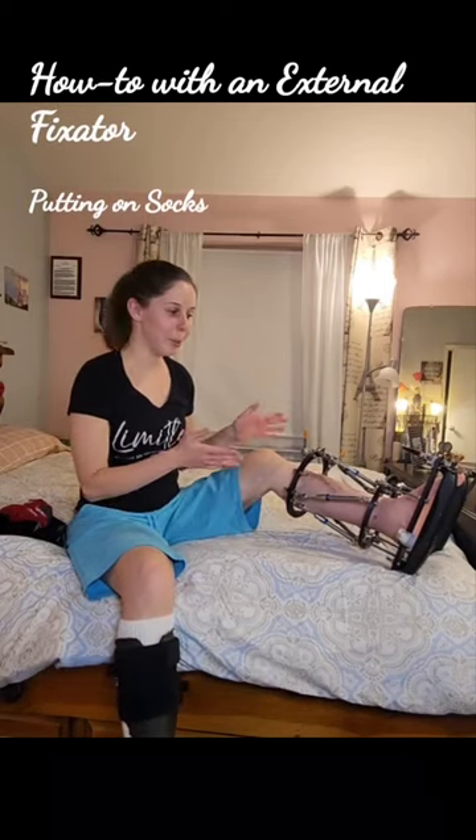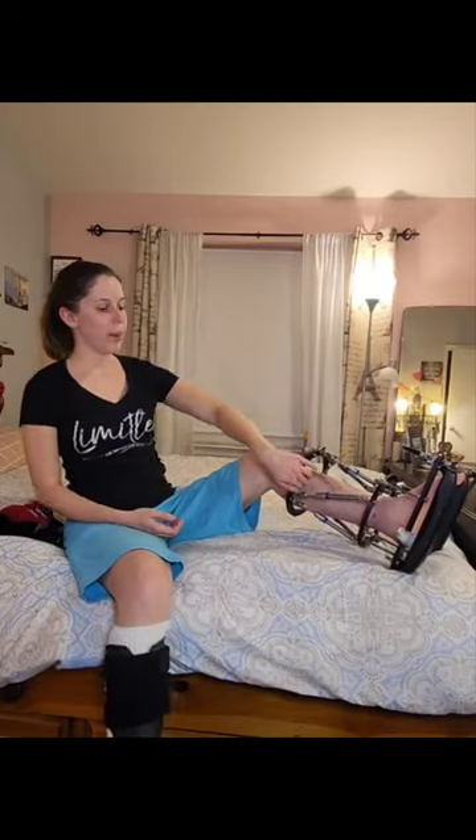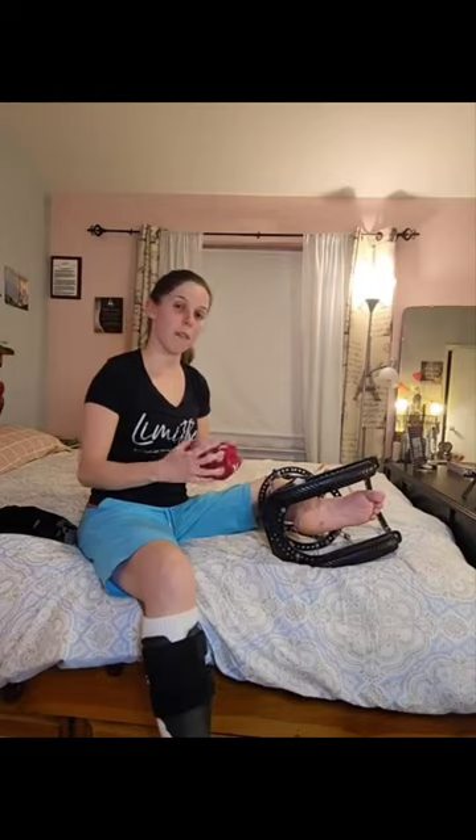So I got a request to show how to put on socks. Of course, your foot's going to get cold down here. There are two screws here in my heel, so I can't really put on socks — but what I do is put on half of a sock.